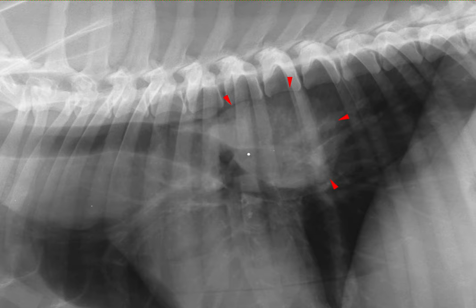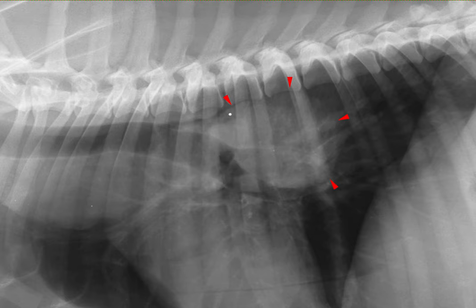A common cause of increased soft tissue opacity in this area, for example, would be the enlargement of the left atrium. However, remember the left atrium is always ventral to the carina, so an enlarged left atrium would cause displacement of this bronchus and the carina in a dorsal direction instead of ventral.